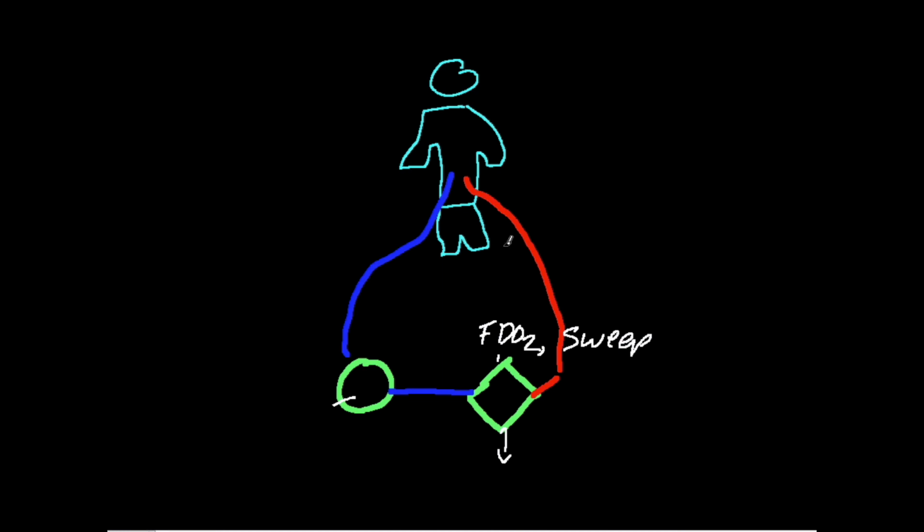So let's talk about a couple of things that you get called to the bedside for and some of the bigger problems that can develop. One term to cover is what's called chugging, and that's a rhythmic movement of the venous drainage tubing. It's caused by very rapid emptying of the right atrium and flow into the tube. And then when the atrium is empty, the tube can no longer fill up.